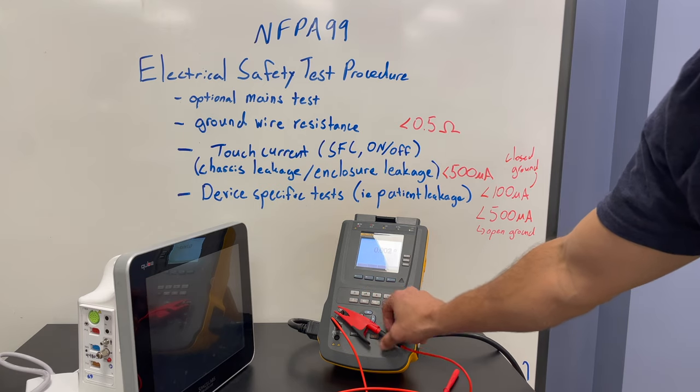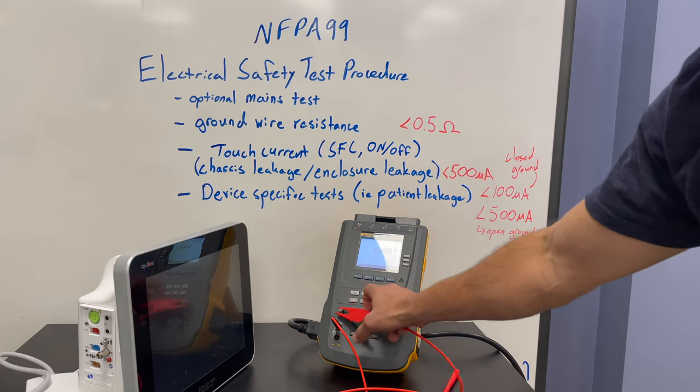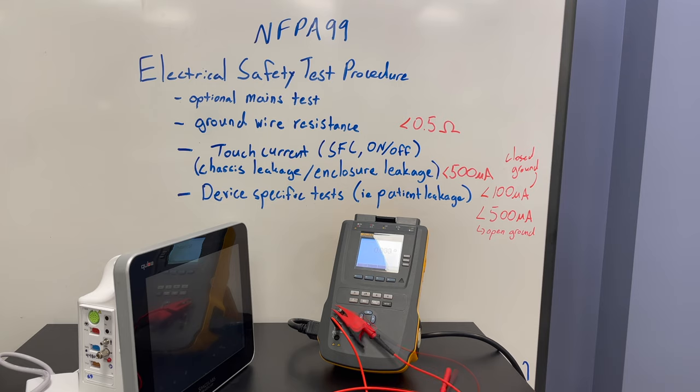You can actually see how contact resistance is affected by wiggling the cord. But we have eliminated the lead resistance once the tester has been zeroed for that lead. Now we can go ahead and hook up the device under test.